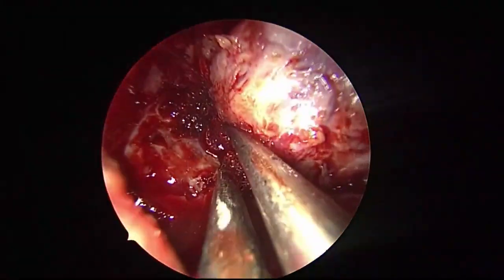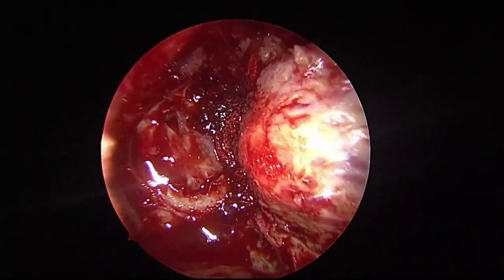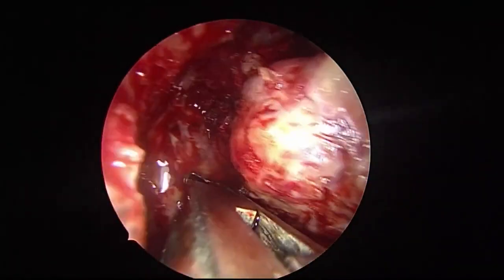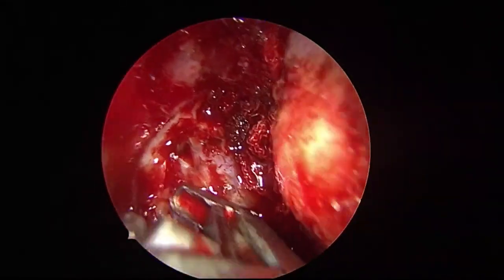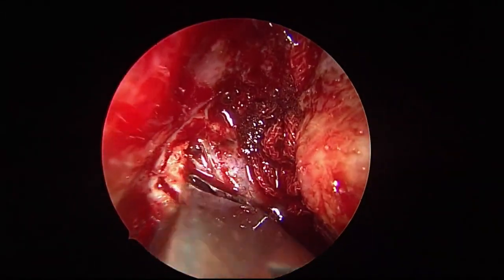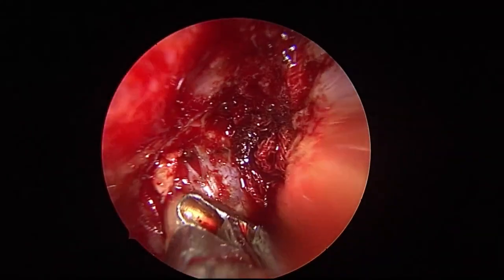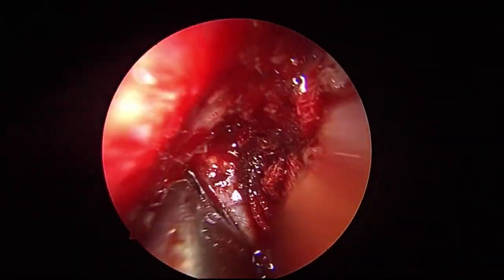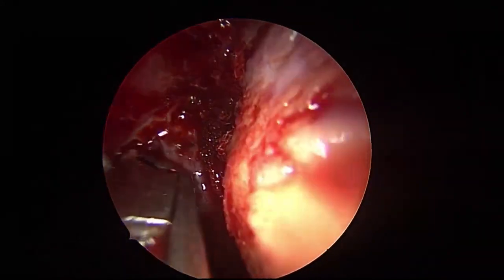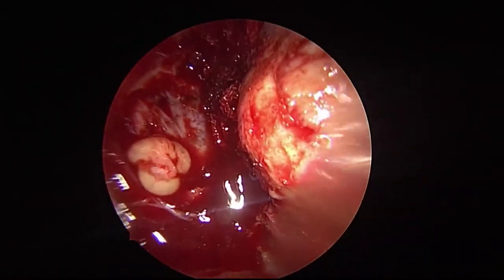This will keep your tumor away as well. Some more bone will be removed. See the periosteum torn. Can you see the fat? Yes, sir. Fat, fat. That means you are lateral to the tumor now. See the infratemporal fossa fat?